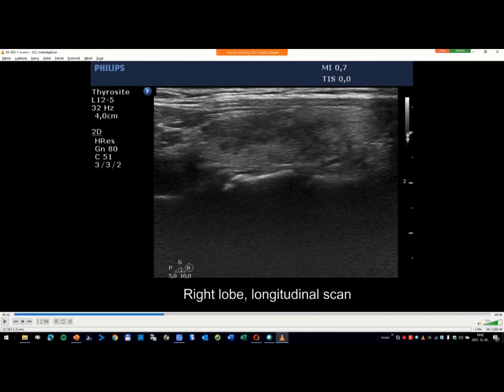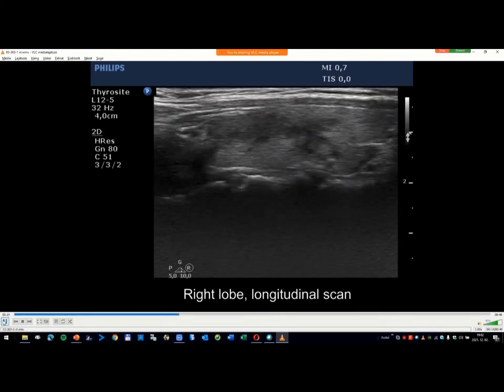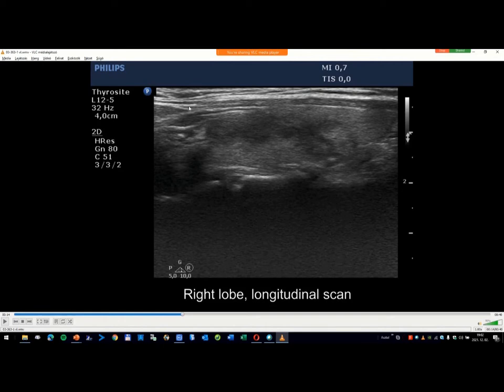Thyroiditis. Okay, thyroiditis. I could not deceive you because I tried to deceive you. This patient had minor tenderness, but this is clearly a very specific pattern of thyroiditis.